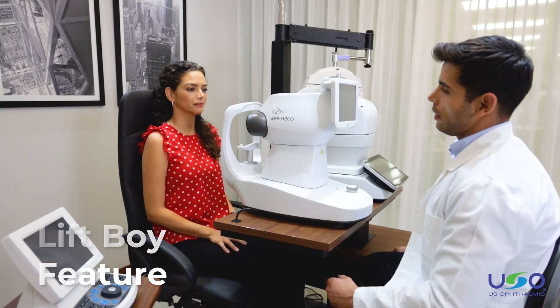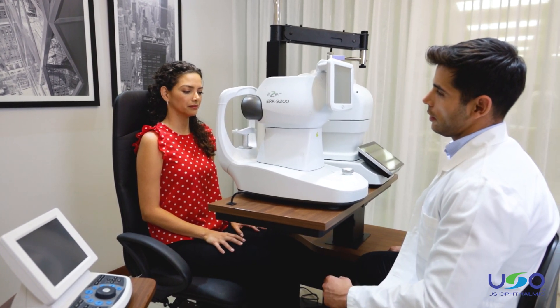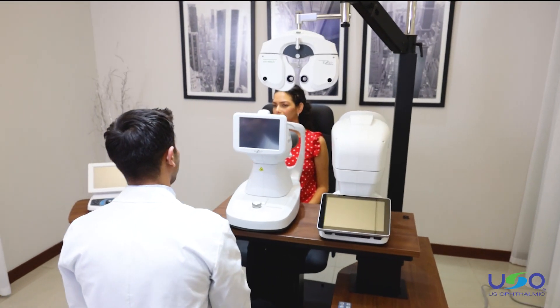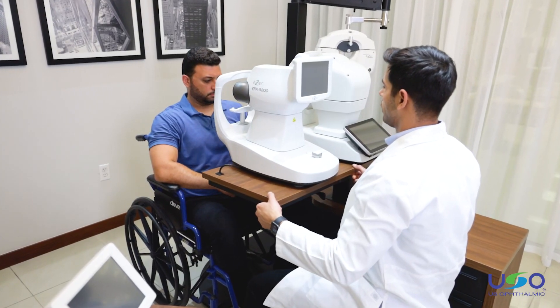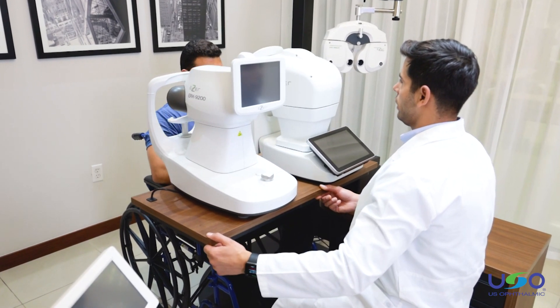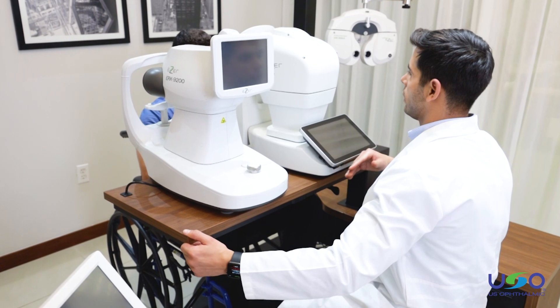The Venetia includes the LiftBoy feature, a unique functionality that is exclusively available from Visionaire. LiftBoy serves to automatically adjust the table height to compensate for the difference in height between both optical instruments on the table. Simply by switching from one instrument to the next, the motorized table will adjust automatically so the table moves to the correct height for the new instrument.